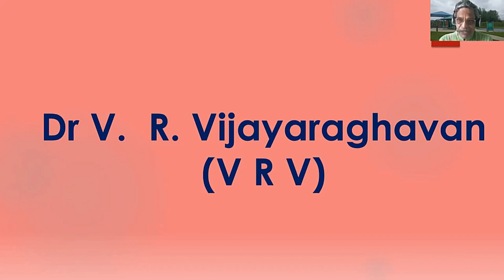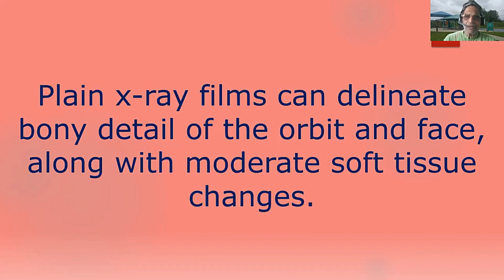Again, I'm stressing now, when you are asked in an examination about orbit X-ray, you tell PA. Nothing else, that's all. You tell PA. Now, of course, these X-ray films, even though they are not commonly used, can demonstrate the bony detail of the orbit as well as the face. They can show some soft tissue changes also.